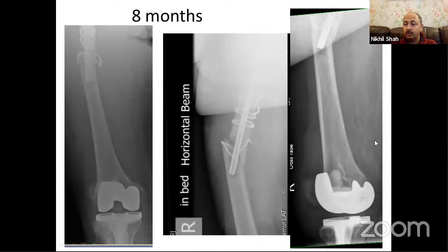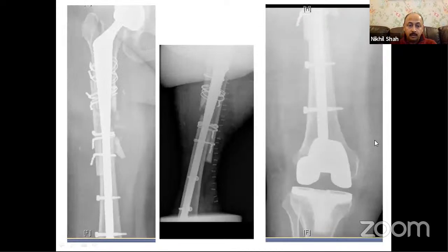So the modern modular conical designs were not universally available. The only interlocking stem I had at that time was a reef stem, and the sizes in the reef stem are limited. So it was either too short or too long. I chose to go a little bit too long, almost up to the knee. The advantage of that in retrospect is that you don't get an interprosthetic fracture, hopefully.